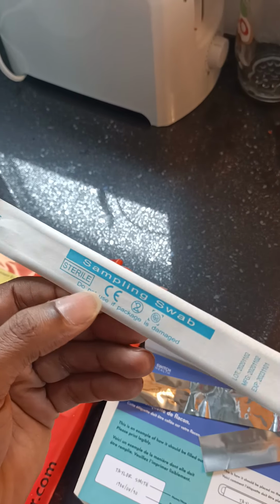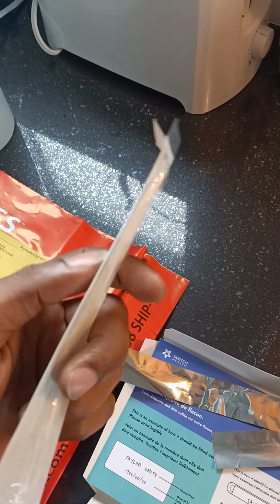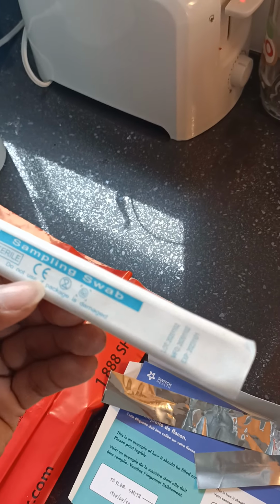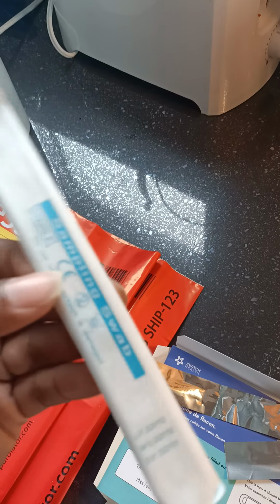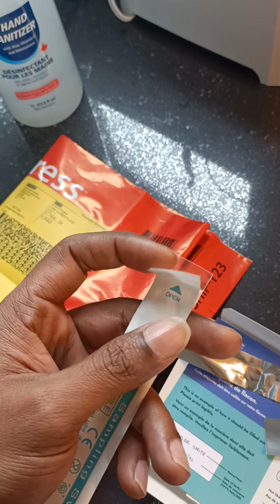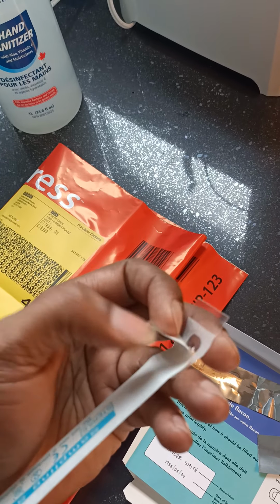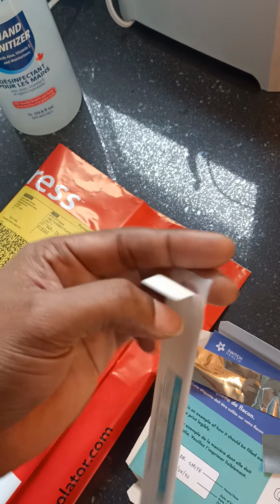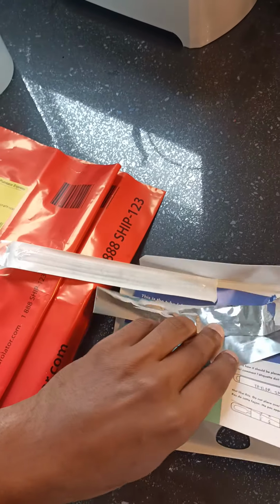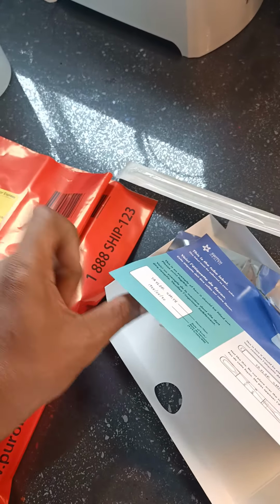This was the package in which the swab is. You have a section over here you can peel off. Once you peel off, you can take from here, because the brush is on this side and the stick is on this side. Once you take that out, you have to do the test yourself.